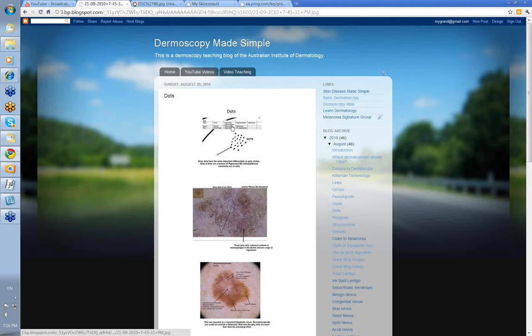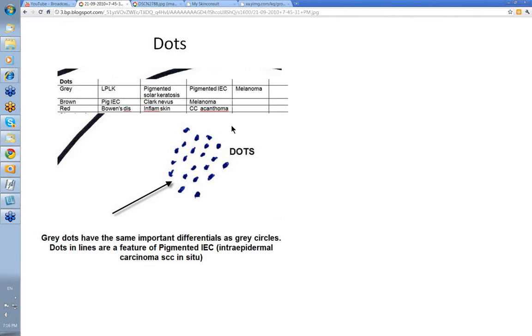Dots come in a variety of colors. They're usually defined as small round structures less than 0.1 mm in diameter, and the colors I'm most interested in are grey, brown, and red. You can of course get black dots, and you may well see these at the edge of a melanoma, representing pigment accumulations up in the stratum corneum, or collections of abnormal melanocytes in this area.